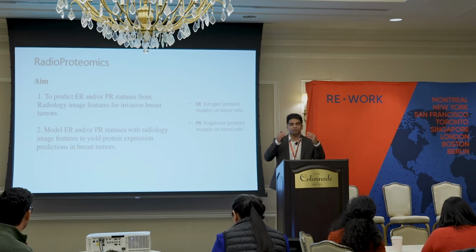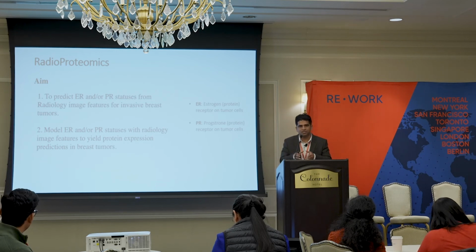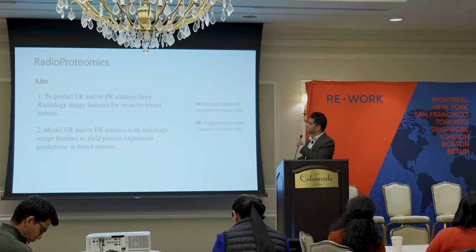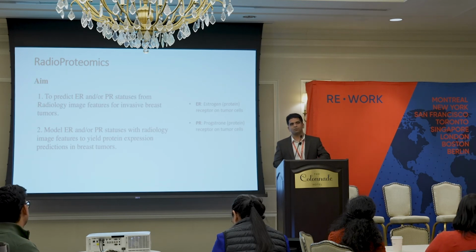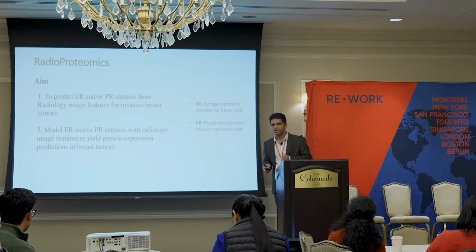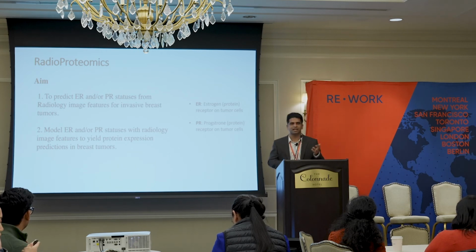We of course wanted to sort manually whether the ER and PR statuses exist for all the patients that we wanted to consider. So we targeted a specific use case, invasive breast carcinoma, as a more specific subset gives a better outcome, especially in cancer. We then tried to predict the ER and PR statuses from these radiology image features. Whatever prediction we got, we merged with the imaging features to explain the heterogeneity of the tumors on the radiology images, and we predicted the protein expressions in these tumors, which were measured by RPPA assay by well-known institutes like MD Anderson.